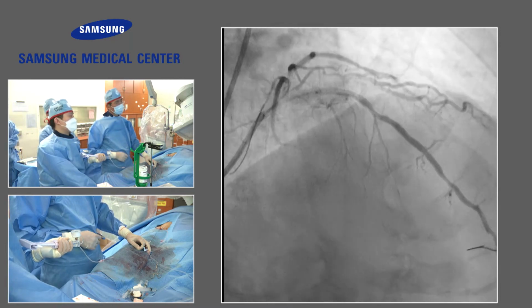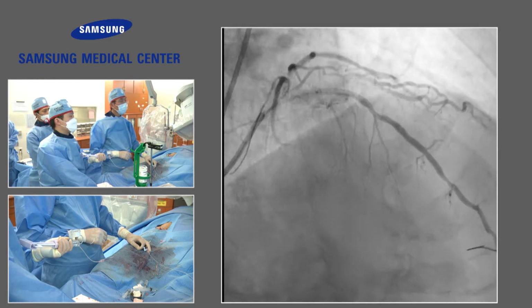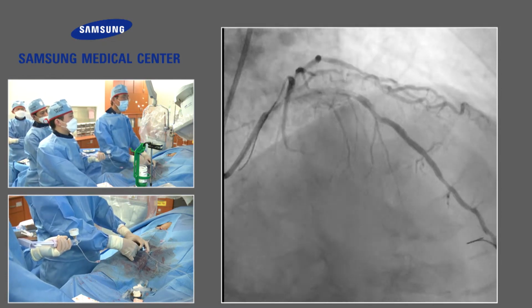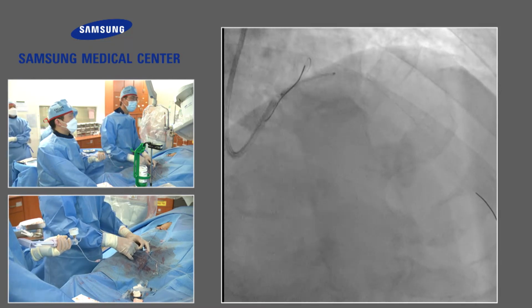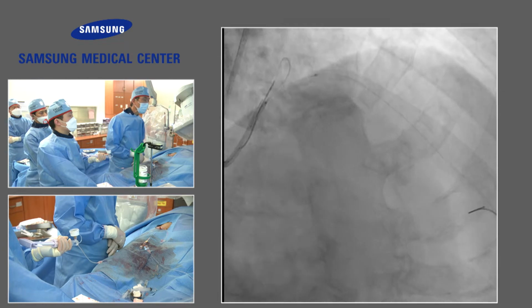After the end of the stent deployment, please tell us the final lumen size. Oh, sure. Stent expansion. Okay, you're right. Before the wire removal, I'd better use the high pressure. Yeah, I got your point. Distal part, I got your point. Inflate that, and then remove the wire from the diagonal side branch.